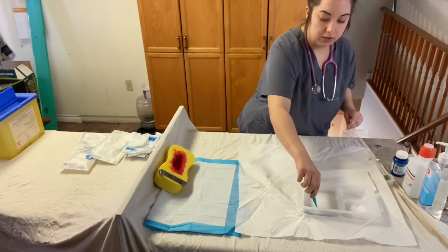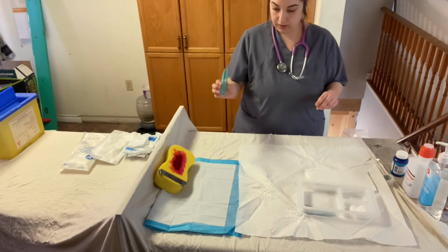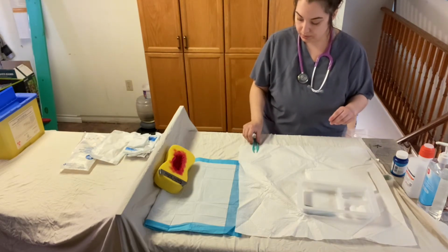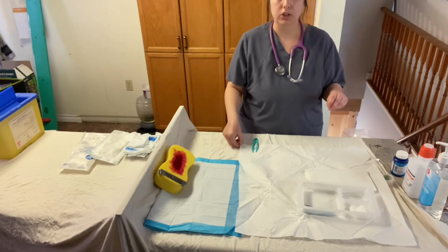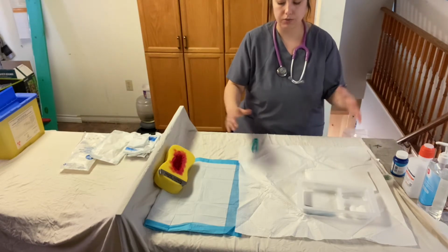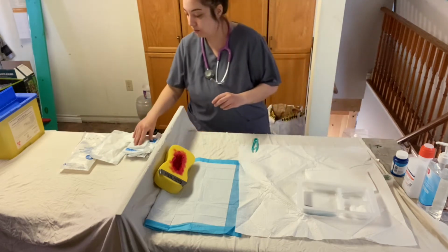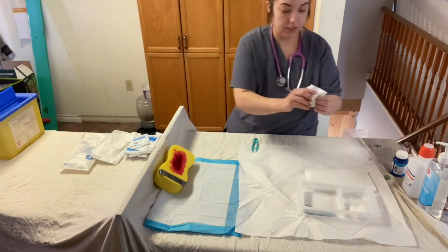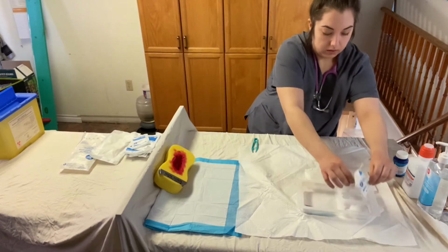Inside there's some 2x2s and a couple pairs of sterile tweezers. I'm going to be placing this within my 1-inch border there, my sterile border. As I touch this with my fingers as well, I'm always ensuring I am not touching within the sterile field, only outside of that 1-inch border. Next, I'm going to start by placing in some 2x2s, and I'm just going to put them in the same tray as slightly over top.